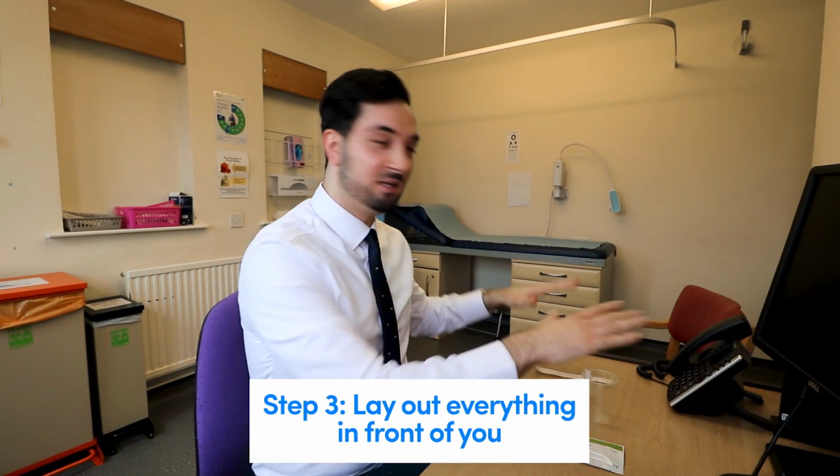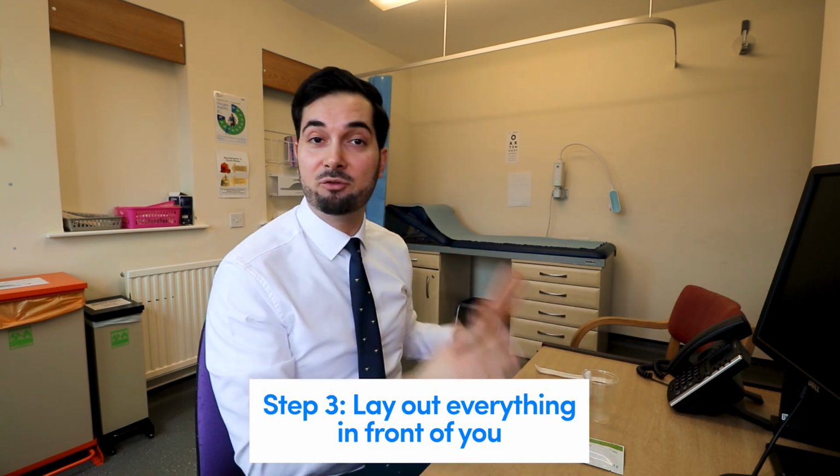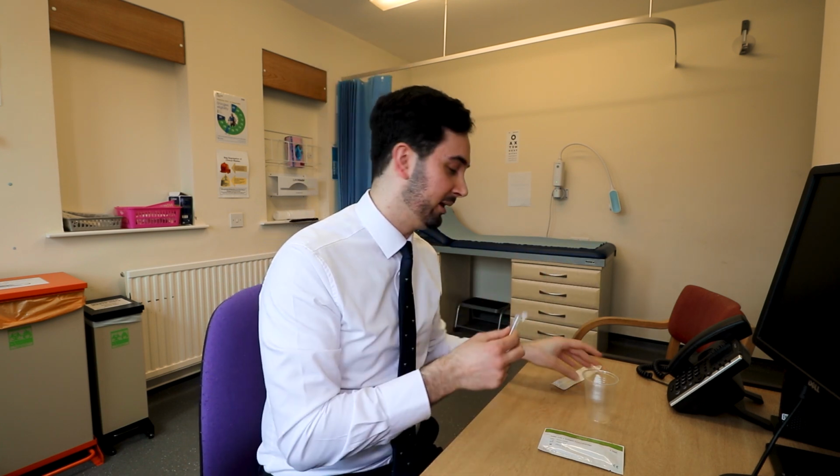Okay, so moving on to step number 3, I've changed the angle slightly so you can see the desk a little better. You're going to lay out everything that you need for this test. So we've got our disposable swab, we've got our extraction solution, our extraction tube that we spoke about earlier, and how they differ slightly between different kits. You already know about that. You're also going to get a cup. Remember, if you don't have an extraction tube holder, you're going to need a cup just to place this in once you put your solution in there. We're going to go through this bit a bit later, but it's just good to have it ready there. You're going to get your test cartridge and leave it there as well. Also, I like to have some tissues available if I need it. I'm going to put that there as well, so it's nice and ready.